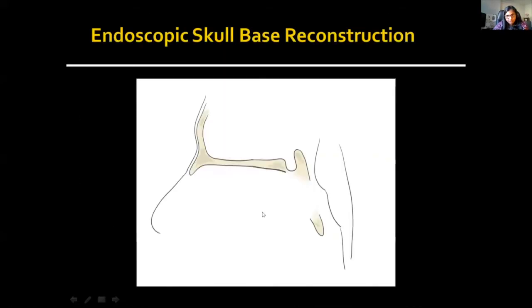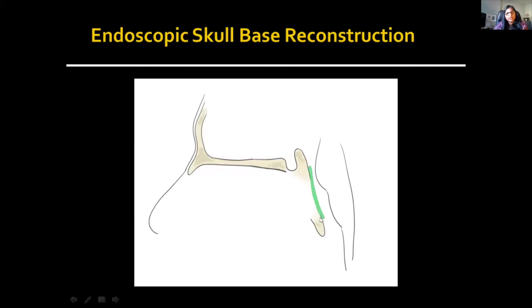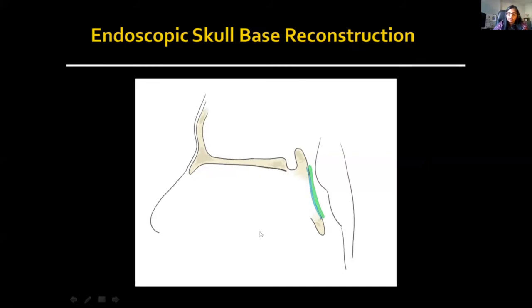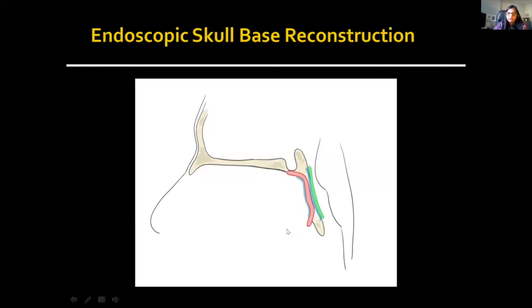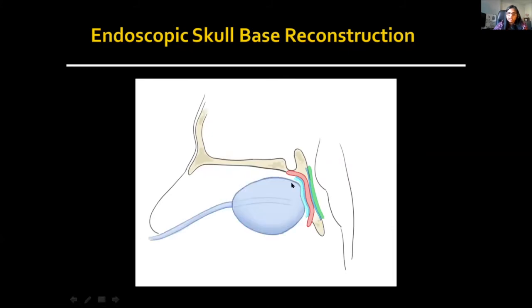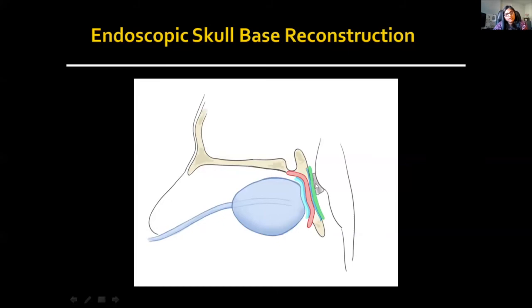For radiology colleagues, a schematic shows the different layers of reconstruction: starting with an inlay fascia lata flap, lined by fibrin glue, followed by the vascularised pedicle nasal septal flap, then a bit of glue and spongiostan, everything held in place by a Foley. Sometimes the intracranial intraoperative bed is left as-is; sometimes spongiostan and surgiseal are added; at other centres fat can be used. It is important to know this to adequately assess findings in the intraoperative phase.